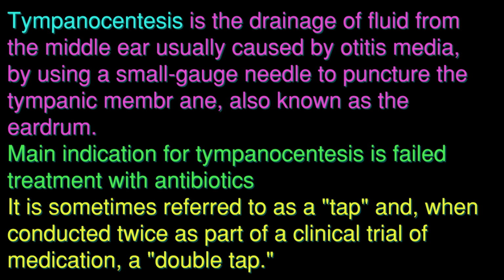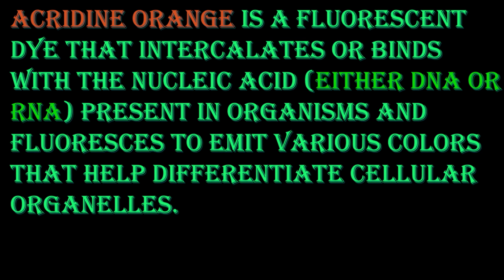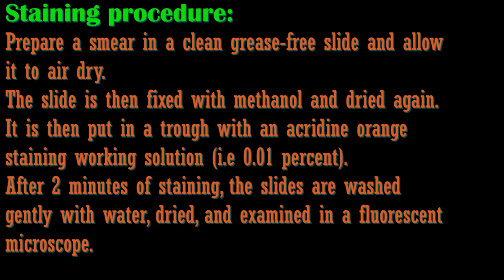Add anaerobic culture plates for tympanocentesis specimens. Outer ear gram stain is done. Blood agar, chocolate agar, and MacConkey's agar are used for inoculation. From eye samples, conjunctiva gram stain, acridine orange stain, and histological stains like Giemsa stains are used.